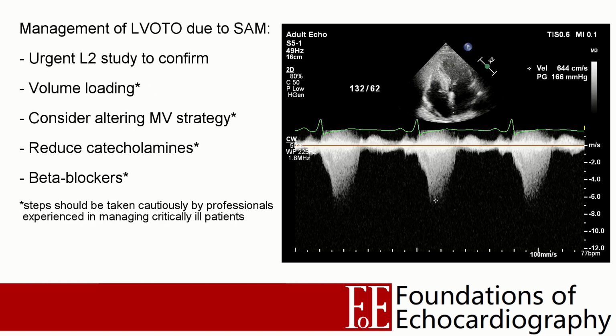The detection of possible SAM in an acutely unwell patient should prompt referral for an urgent level 2 study to confirm the diagnosis and measure the pressure gradient across the left ventricular outflow tract.